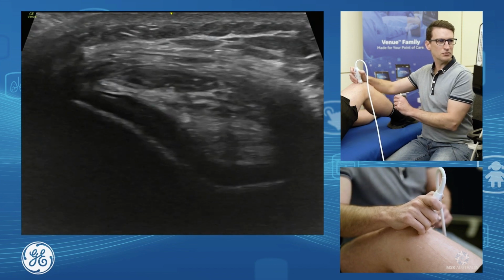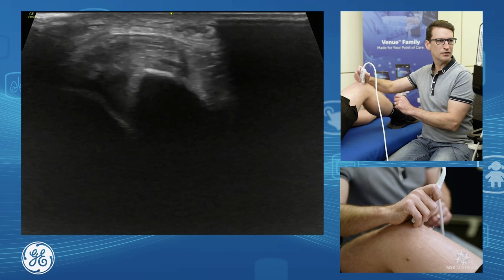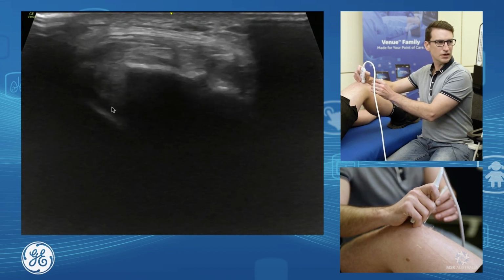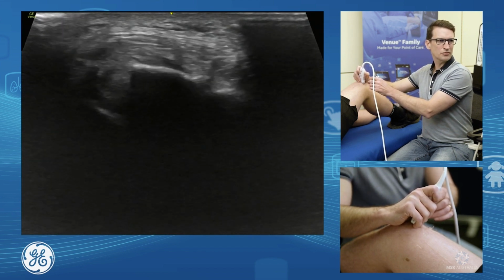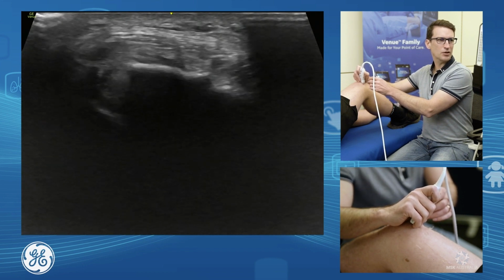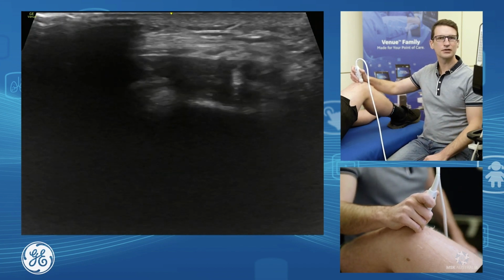Another option, if we're limited with our amount of fluid there, is to come down so we can see our patella and femur, and again just falling into that little V shape left there. What we want to feel is just a lack of pressure. We don't want to see the injectate pooling, we want to know it's running away. As we're pushing our plunger, the fluid is running away, and that's our anterior knee.